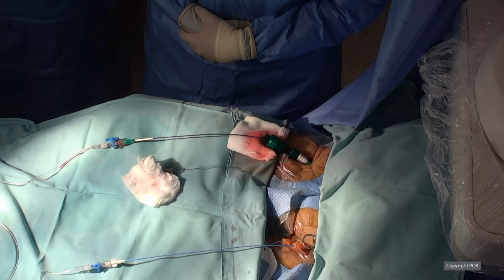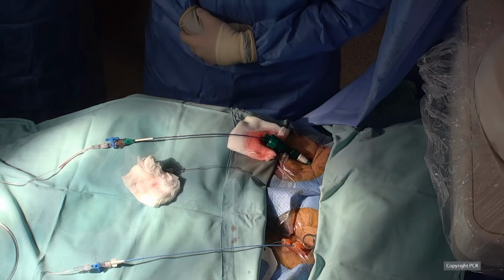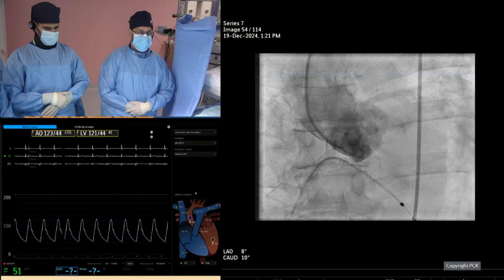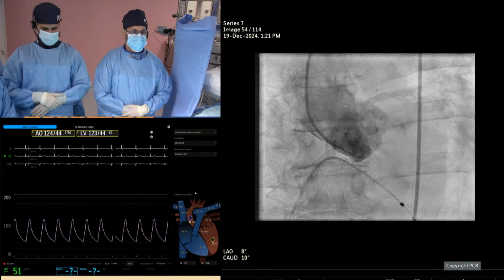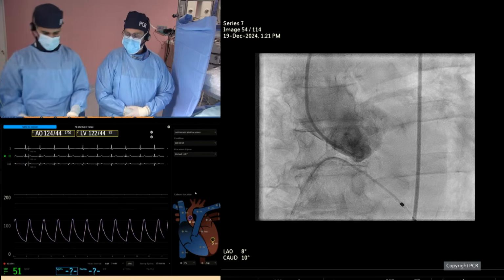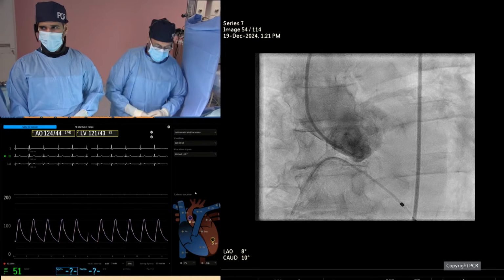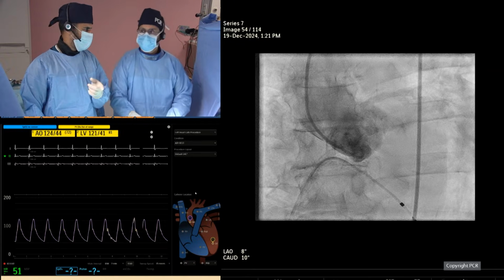The patient has been quite stable throughout the procedure. As you can see on the screen, he remains in sinus rhythm with a normal PR interval, but a right bundle. And we are ready for the next step, which is crossing the valve, documenting hemodynamics, unless there are any burning questions. Are there any questions from the panel? No. None whatsoever. Please proceed and demonstrate the steps.